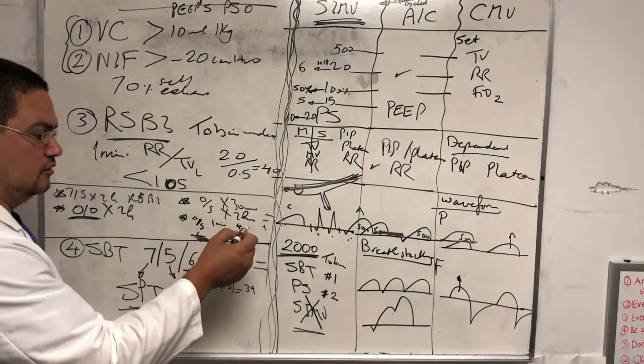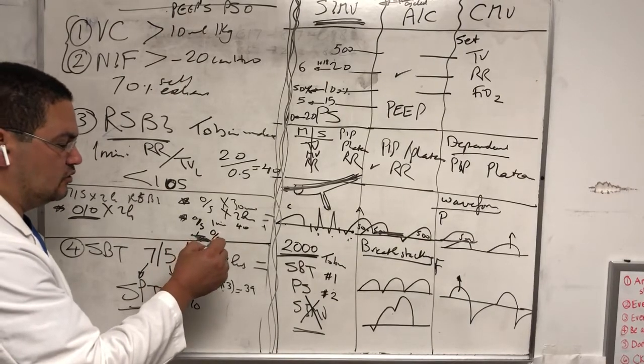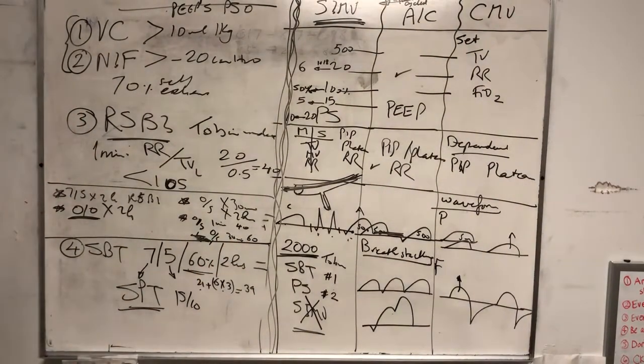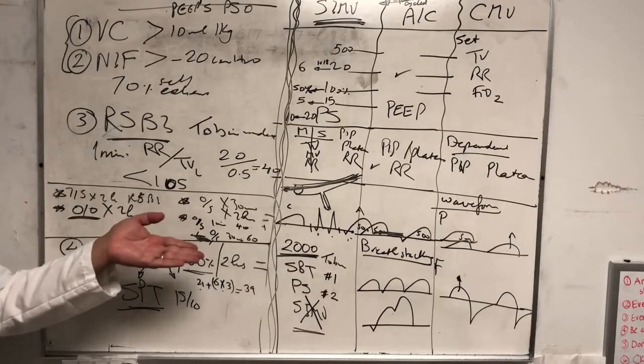So it passed. The patient should be extubated now, right? And then you repeat the same thing, 0/5 at 30 minutes, and it comes out, let's say, 60. Still passed, but they don't extubate. They say it's going up. Of course it's going to go up. You're not going to extubate anybody, right?